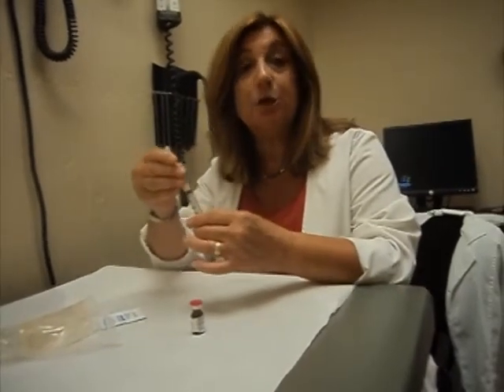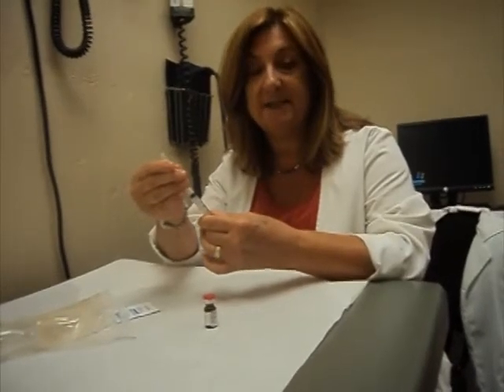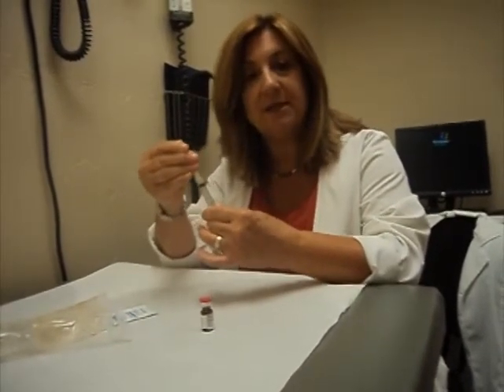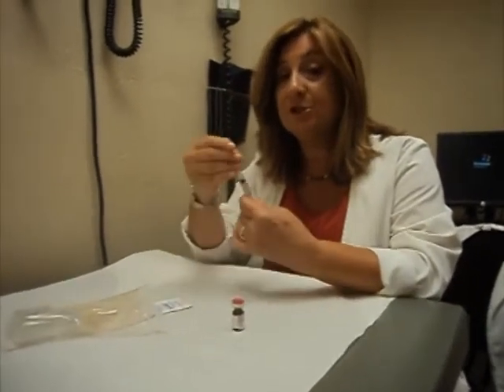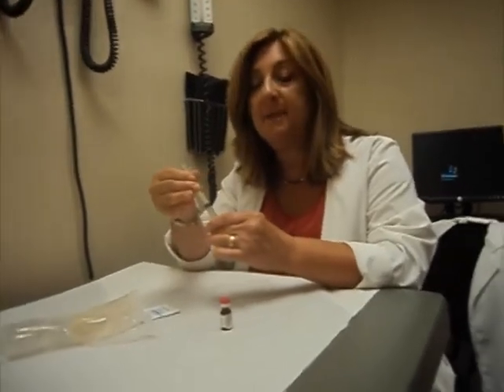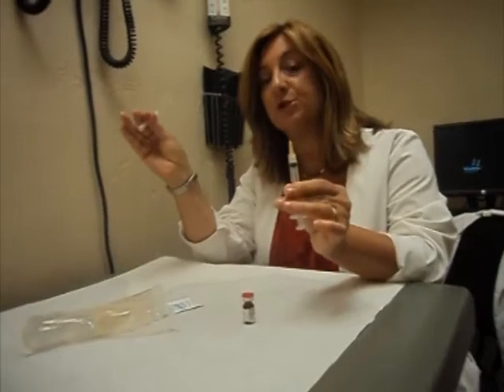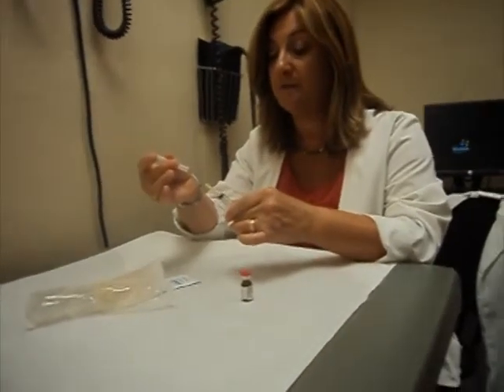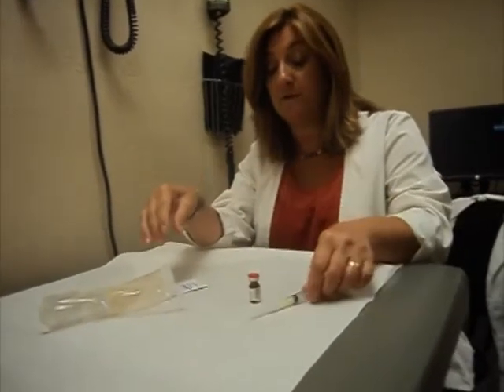Needles may be a little loose in the packaging, so you just want to tighten the needle by twisting it clockwise and making sure the needle is on firmly. Something I remember from nursing school is needles twist on, therefore your tightening of the syringe, and caps pull off. So that is something that may help you remember so you don't twist off the needle when you're pulling off the cap. So we're just going to loosen the cap at this point, but keep the needle covered.